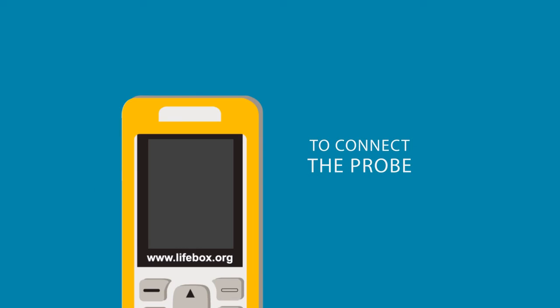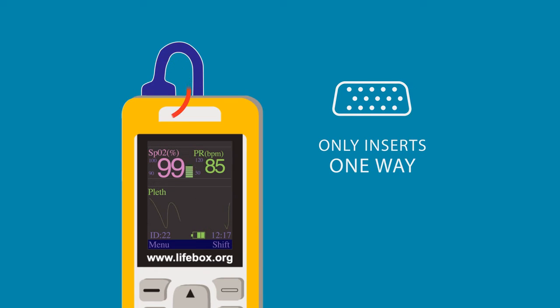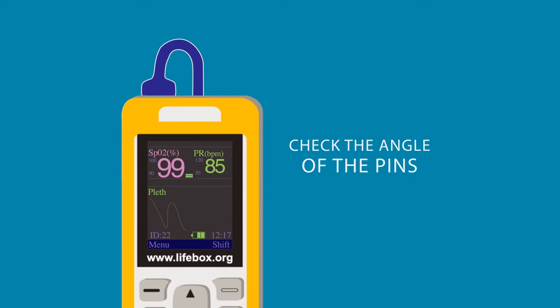To connect the probe to the oximeter, plug the base of the probe into the top of the oximeter here. Note that the probe only inserts one way. The pins are arranged in a sloping shape. It is very important that you check the angle of the pins and the angle of the receiving end of the oximeter before trying to connect the two.